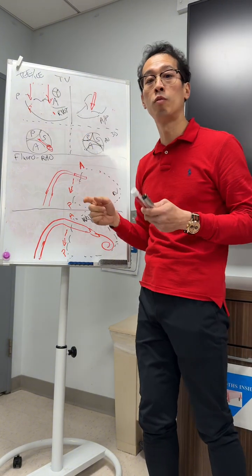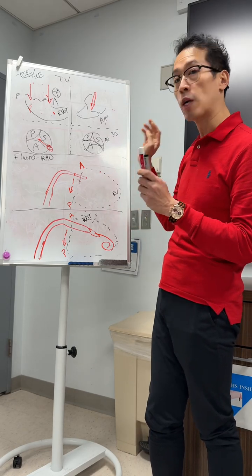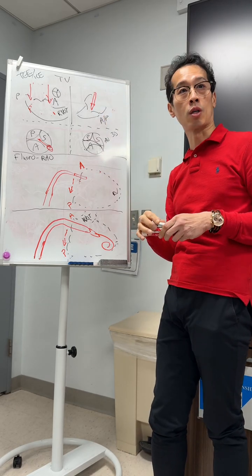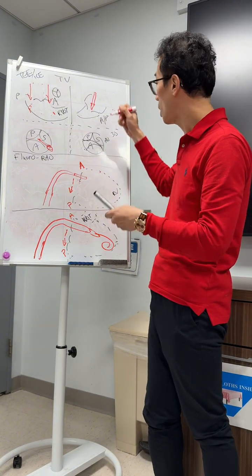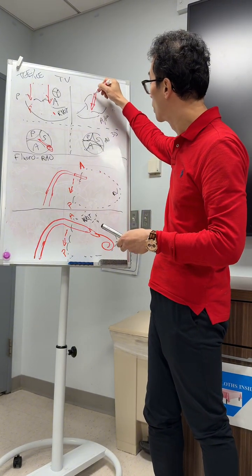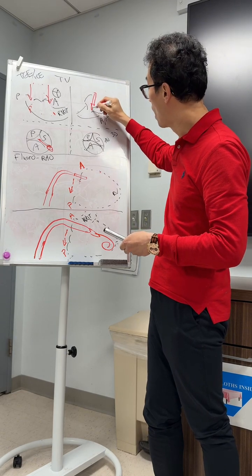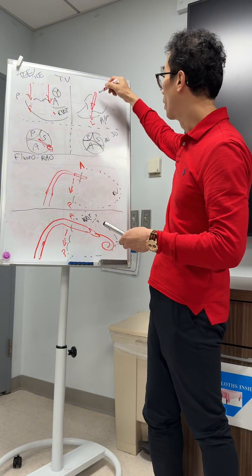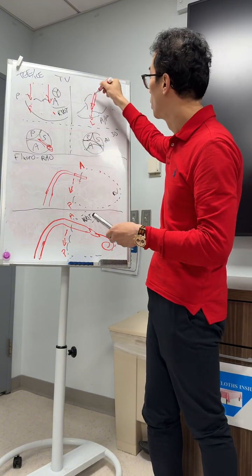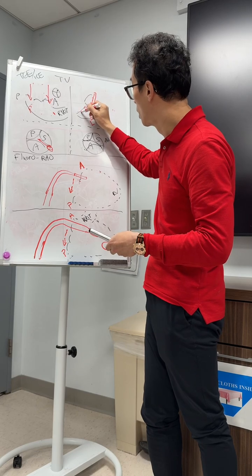The next set of movement that is very important, okay, and is critical, especially TTVR, is this whole concept of septal hugger, right? So what does septal hugger mean? Let me go back to it. Is that the device is biasing towards the septum. So you have what we call a lateral dive. Okay? If it's a reverse septal hugger, you're going to be going more a septal dive.